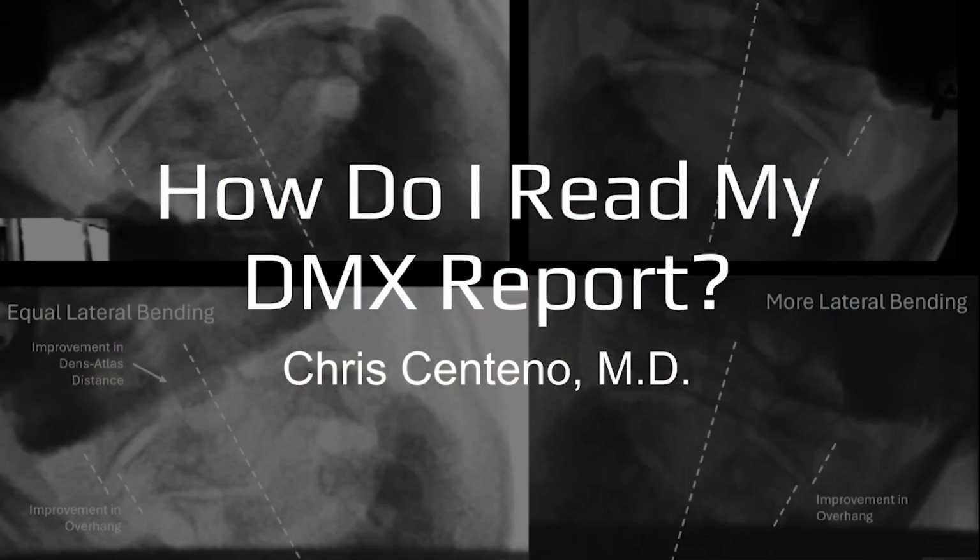Hi, it's Dr. Centeno, and this is how do I read my DMX report? Now, this is a question I get all the time.